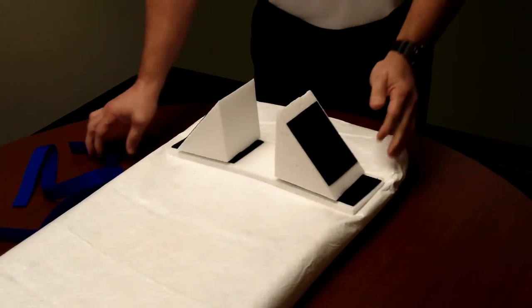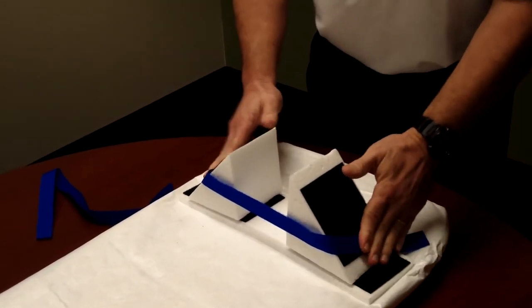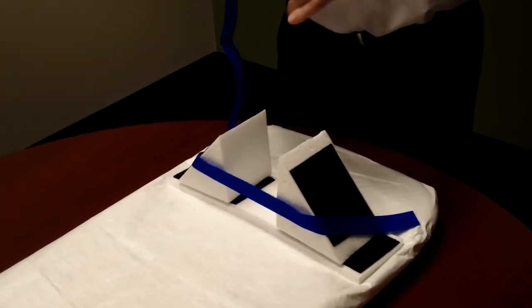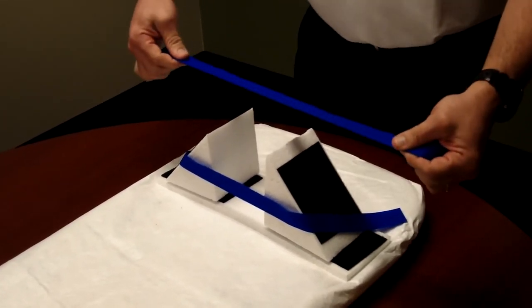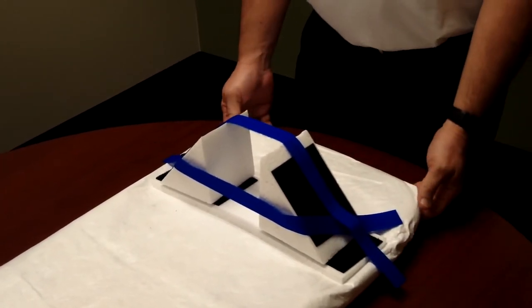You firmly push down on the head blocks. One strap goes under the patient's chin and velcros to the head blocks, and the other strap goes across the patient's forehead, securing the patient's head securely to this backboard.